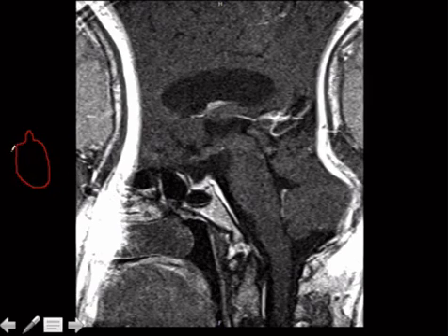There would be more of them than if you did slices in this direction. So this front to back is the phase encoding direction. So we're seeing wrapping around occurring in that direction.